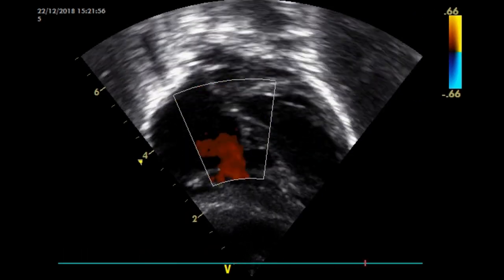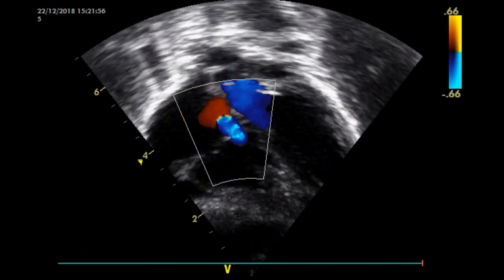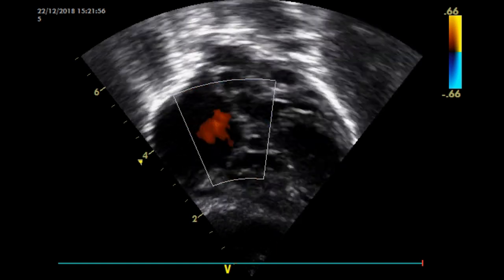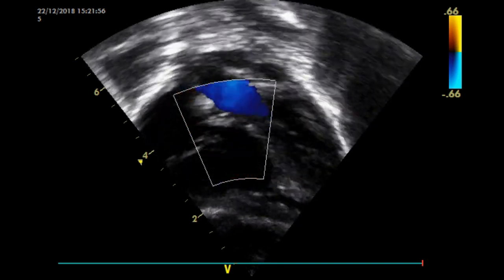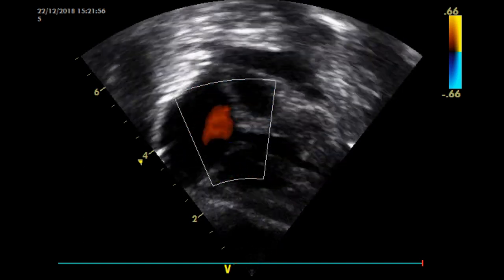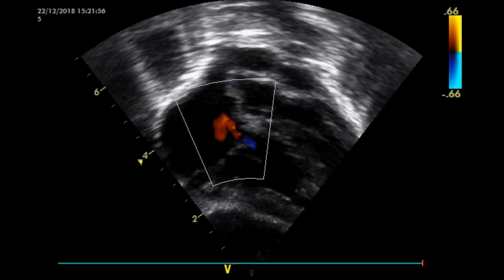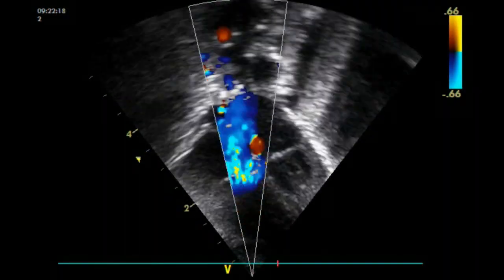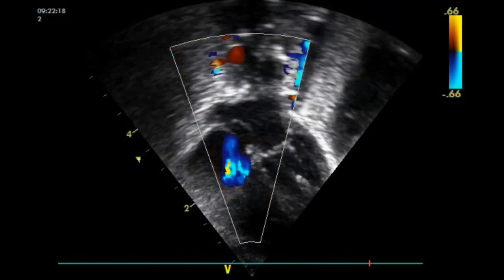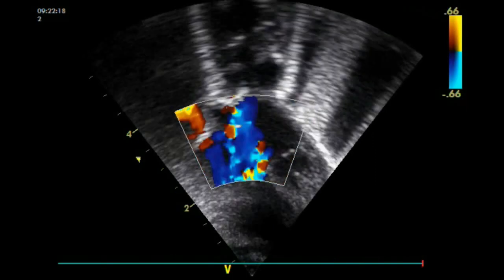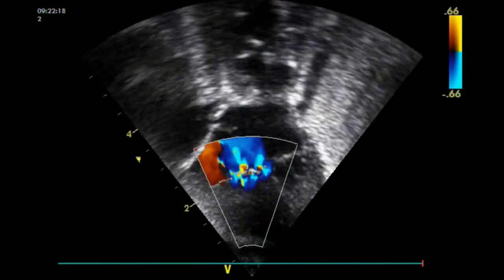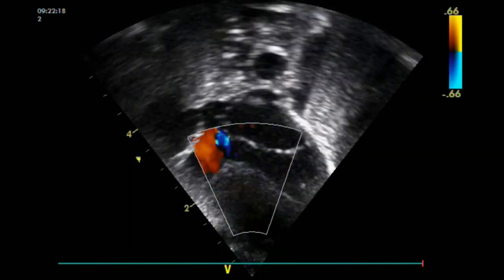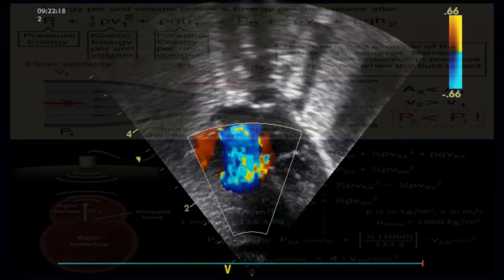The most common method used for assessing pulmonary arterial pressure is to perform continuous wave spectral Doppler of the tricuspid regurgitation jet. Most patients will have a degree of tricuspid regurgitation, which is often — though not always — made worse when the right ventricle is operating at higher pressures.